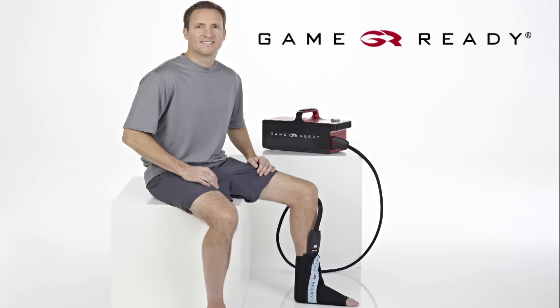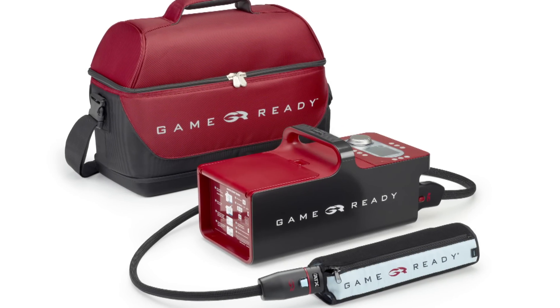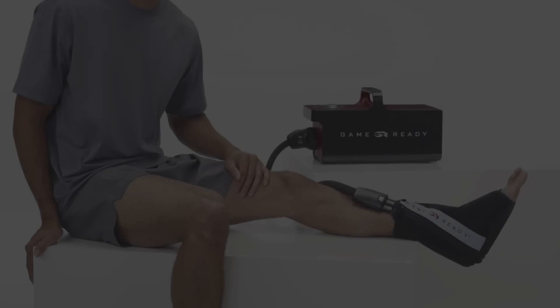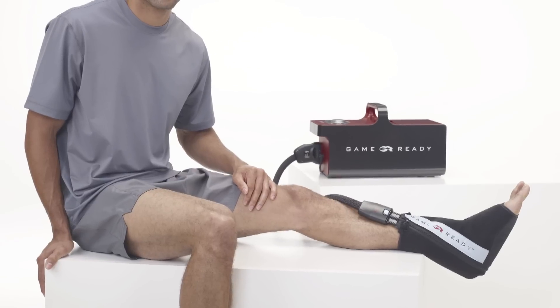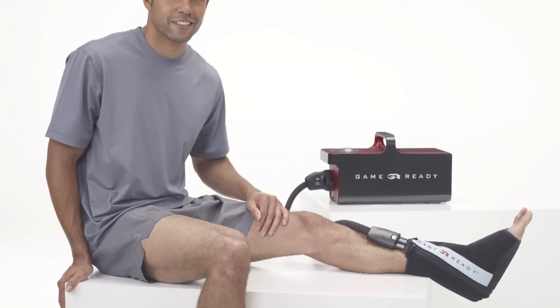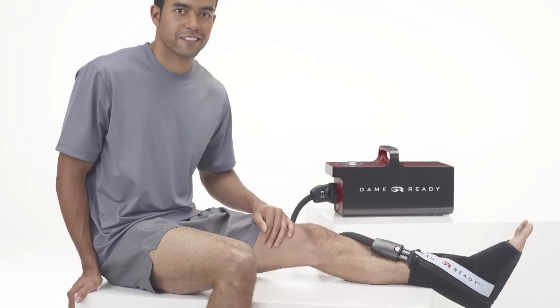Welcome to the GameReady ankle wrap application video. GameReady uses AXEL technology to apply cold and active pneumatic compression therapy, designed to help you recover from your injury or surgery as quickly as possible. This video will demonstrate how to apply your ankle wrap.